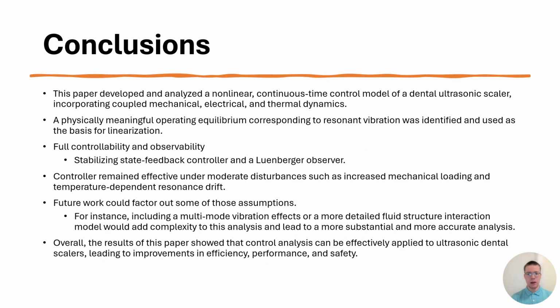So in conclusion, this paper presentation developed and analyzed a nonlinear continuous time control model of a dental ultrasonic scaler, incorporating coupled mechanical, electrical, and thermal and fluid dynamics. A physically meaningful operating equilibrium point corresponding to resonant vibration was identified and used as the basis for linearization.